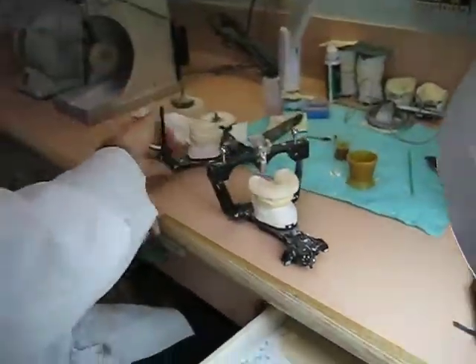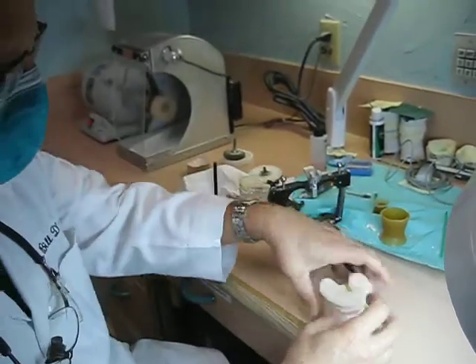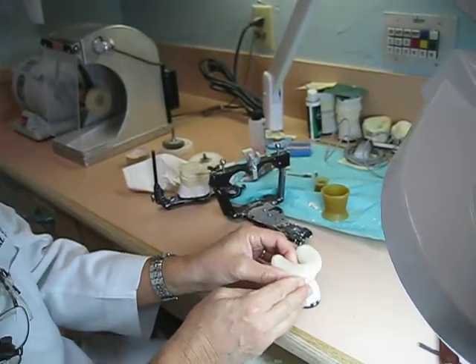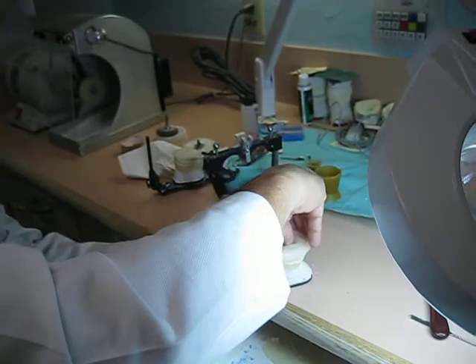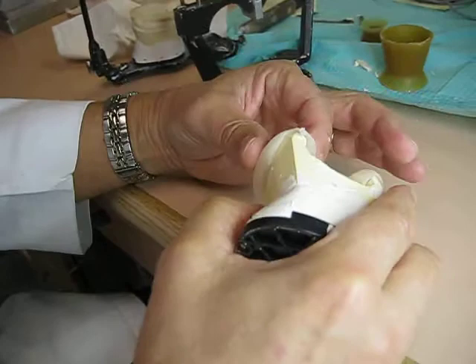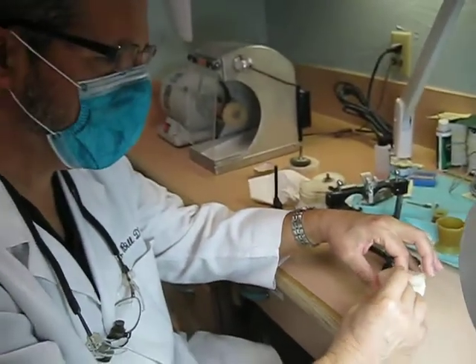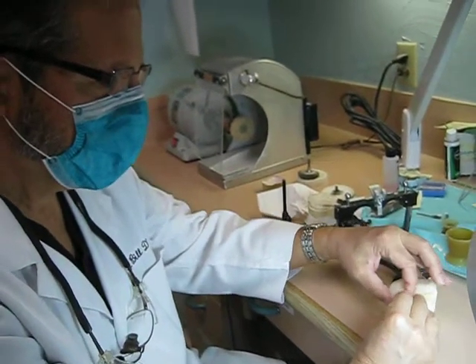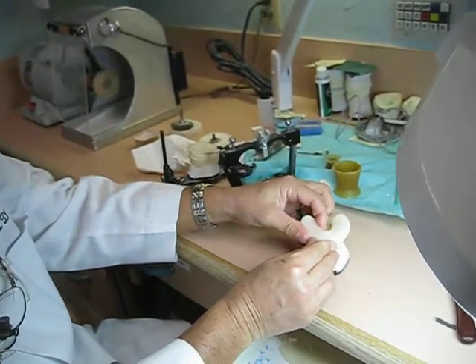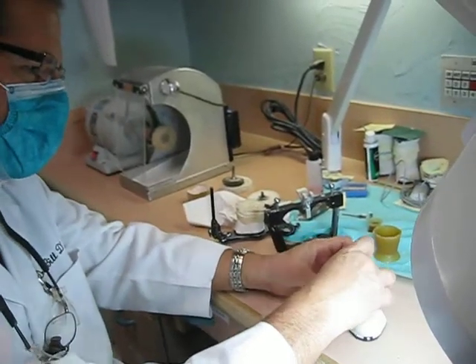And then, once I get that impression in that doughy acrylic, as this is starting to get hot, and it is, I continue to press it against the model because it will try to flare away a little bit. You can see that. Okay, so this particular resin needs a lot of hand work. And now it's getting warm, but it's not hot. But what I'm doing is I'm just continuing to tell it memorize the tooth surfaces. That's all I'm doing with my fingers.